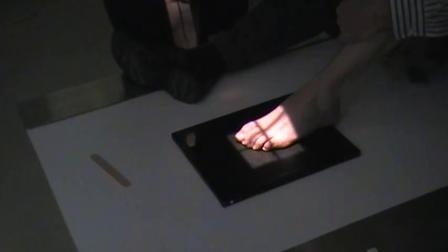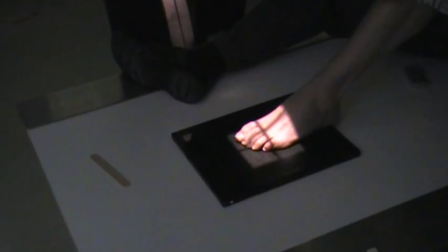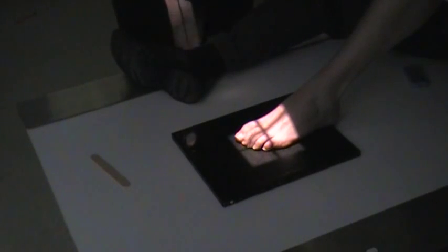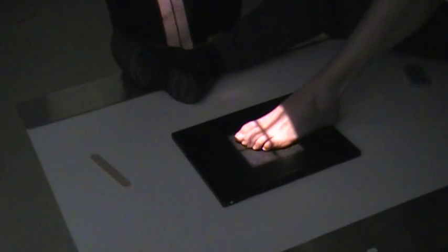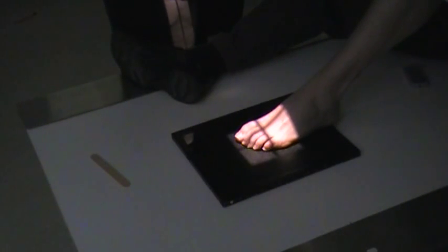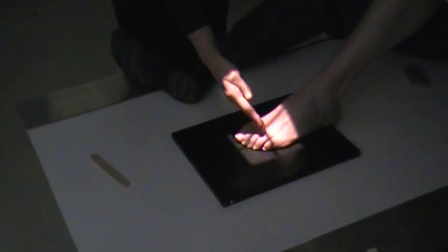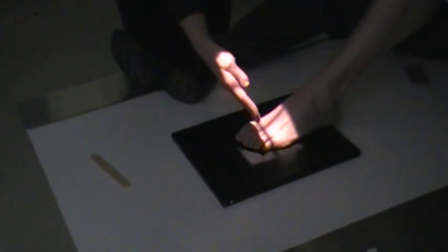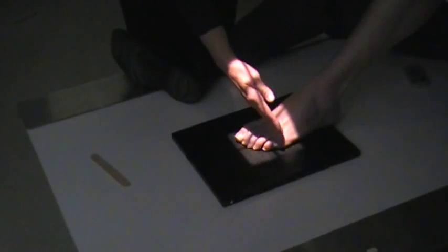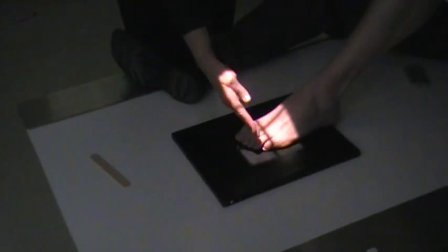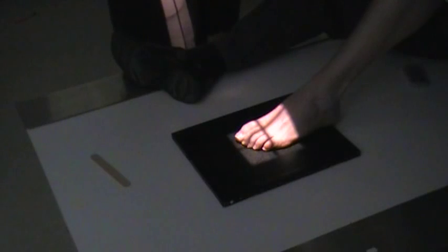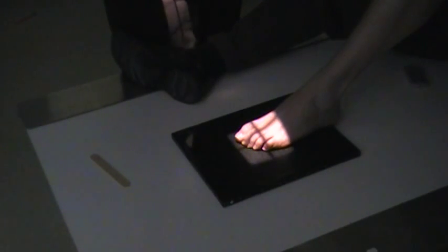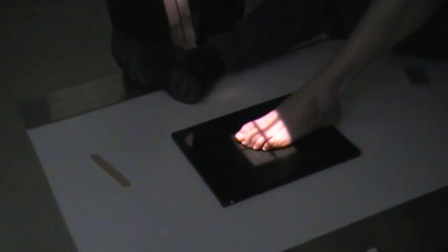For imaging of the toes, you do not need the entire foot, so be sure that you collimate down so that you can have tips of the toes and beyond the proximal portion of the metatarsal. I like to go about halfway into the metatarsal area.